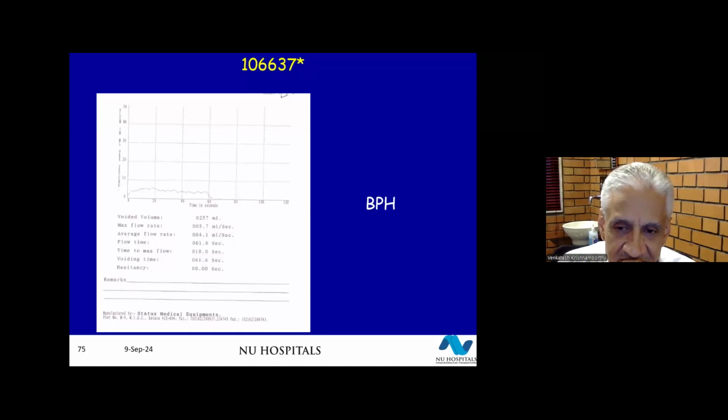there's a continuous mechanical resistance against which he is voiding. So the problem is not with the bladder pressures, but it is mainly with the mechanical obstruction. So typically, the maximum and the average flow rate will be almost the same. So typically what happens is the bladder starts emptying. The urine comes out into the urethra to whichever level the stricture is, and it's a fixed obstruction. So because it cannot take the entire volume, typically what happens is it is like an overflow phenomenon.